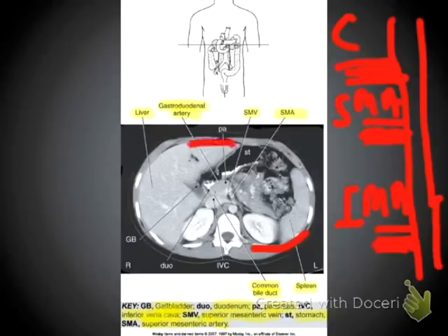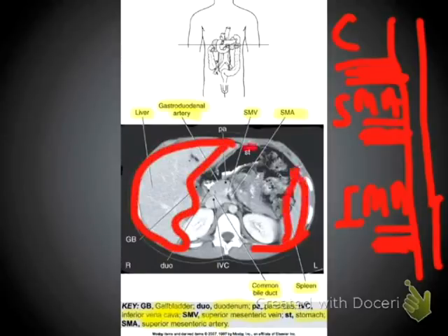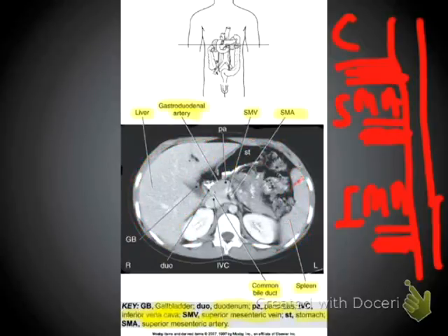So as we're looking at this image, we have the liver, spleen. We have the stomach here, which is probably the body. Pyloric antrum around here. We have both left and right kidneys. We have the inferior vena cava here, aorta here. And then we have this structure coming off the aorta there. And that is the SMA based on the location of the scan field where you're at, where we're actually scanning. And I believe we've covered everything on this image.